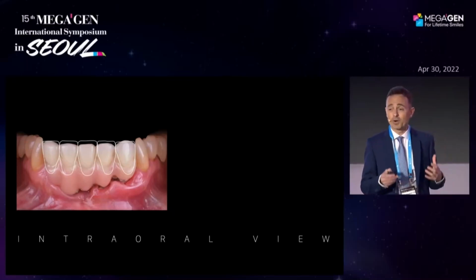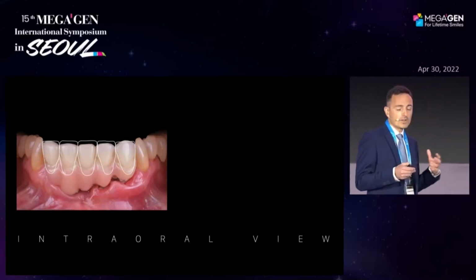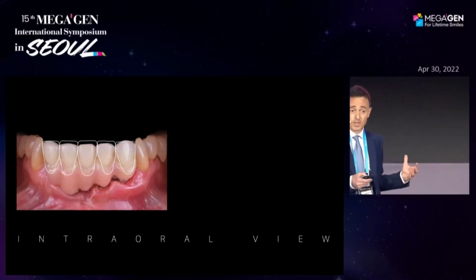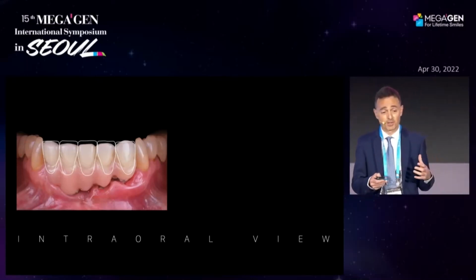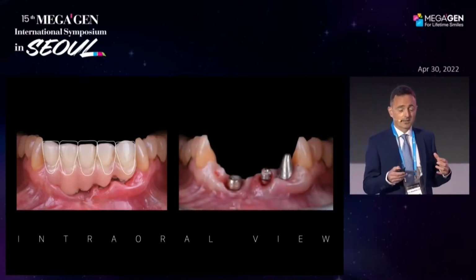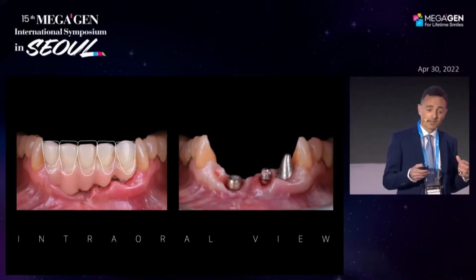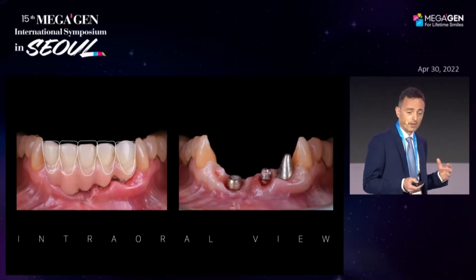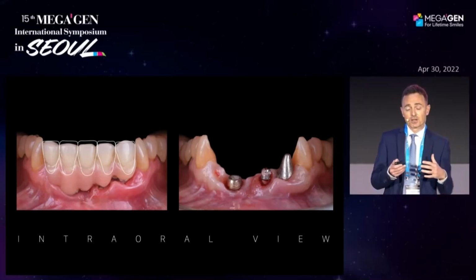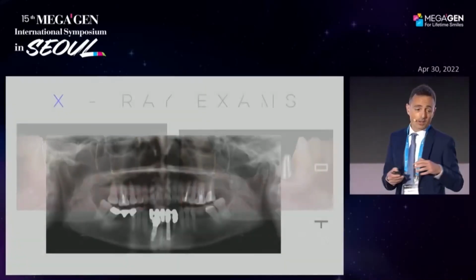So the first consideration that I would like to share with you is that, evaluating the initial clinical situation from a prosthetical point of view, we would like to reach longer teeth compared with the ones that we already have in the mouth of the patient. And once we remove the little Toronto, we can see that it was not an implant-supported rehabilitation, but there is also a tooth, and we have a lack in vertical dimension of hard and soft tissue.